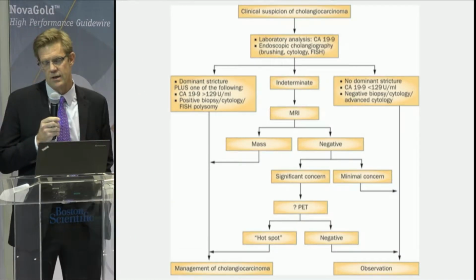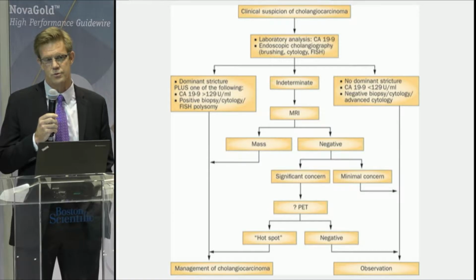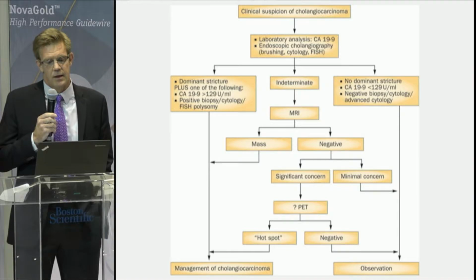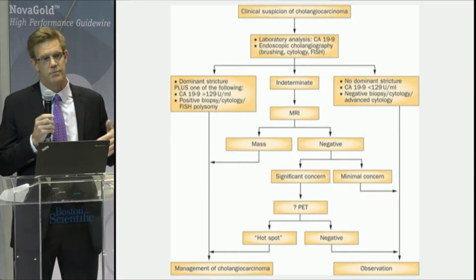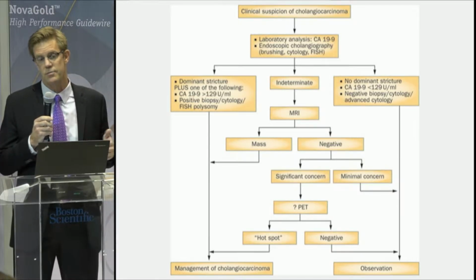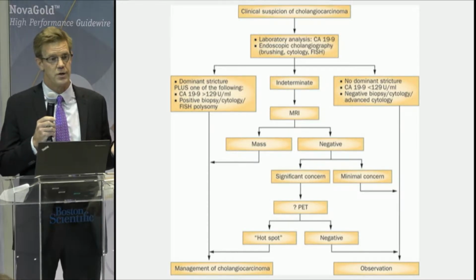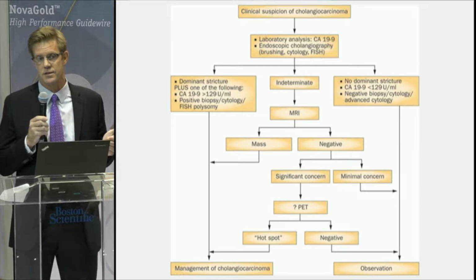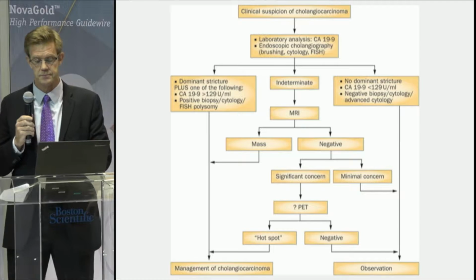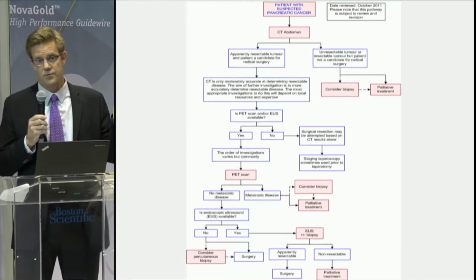But even with that, as I've been telling you, for cholangiocarcinoma, with all those tools, our algorithms still do not serve our patients well sometimes. Our traditional workup, including multidisciplinary care, laboratory evaluation, cross-sectional imaging, ERCP, and cholangiogram information, still leaves us with a significant portion of patients who go to surgery potentially not having a diagnosis, because cytology is not great, and not knowing the extent of resection that is going to be required for the patient. And the same is true in some cases for distal disease.